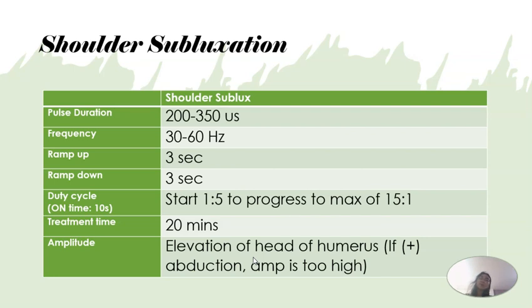The motor point is the area where you need only a little electric current but it can give you an optimal contraction.